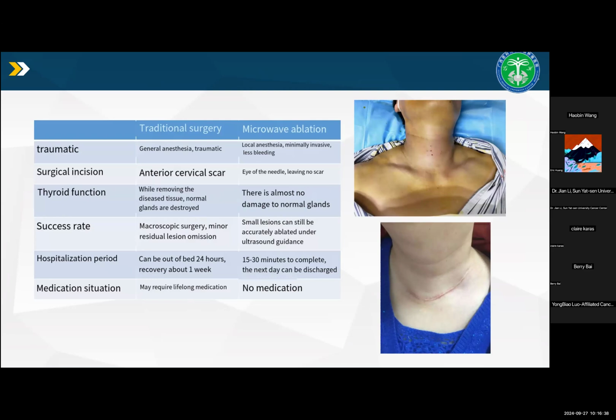Microwave ablation is a very minimally invasive treatment and a therapeutic operation. For benign nodules, ablation therapy has the advantages of small damage, quick recovery, good rapidity, retaining the function of the thyroid, and not affecting the appearance. But it still belongs to a category of surgery and will inevitably have an impact on patients.